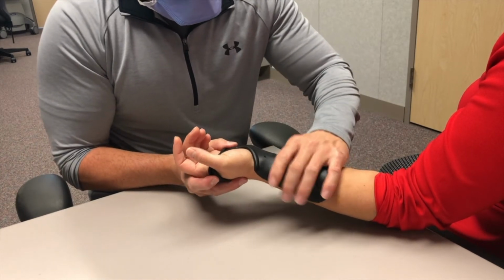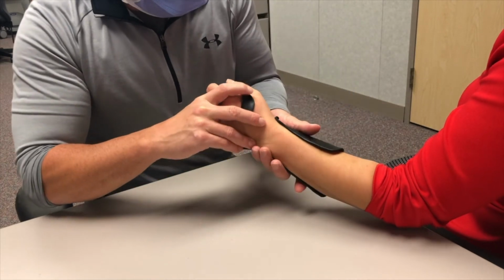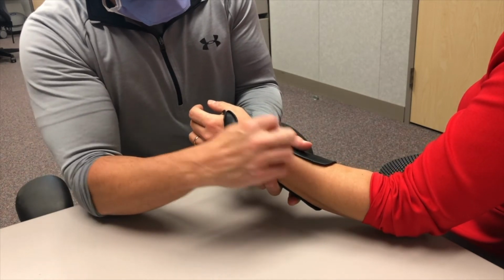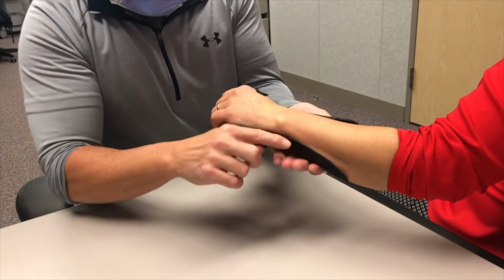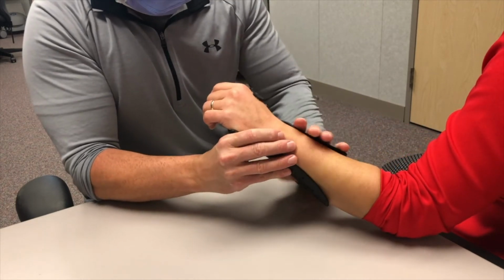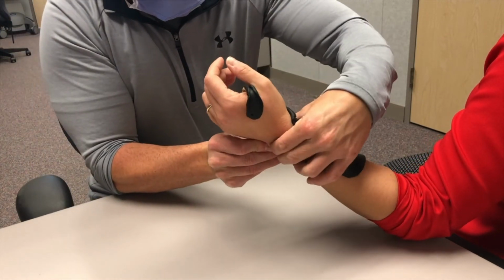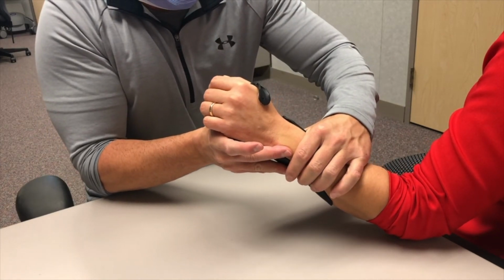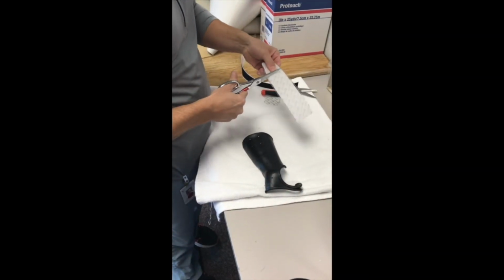So now that it's formed, okay, it is fairly warm. We want to look to ensure that it clears the radial styloid, and it does, so it doesn't look like it's going to pinch on that structure. We want to just make sure that it's approximately half to 2/3 of the width of the forearm, which it is. And when we try to pronate and supinate, we check if it's impinging on the ulnar head, and it appears to not have any pinching there. We want to make sure we round our edges when we're cutting.